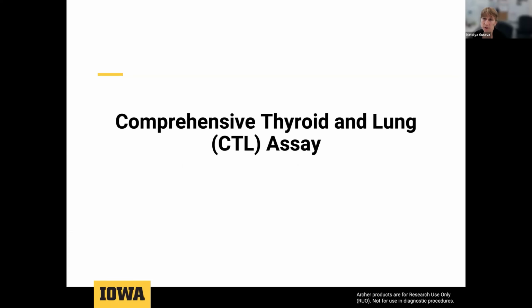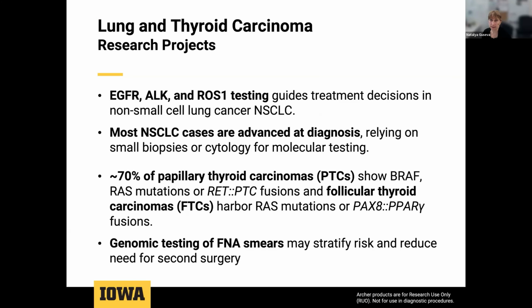On the next project, we were thinking about lung and thyroid specimens. Molecular testing is important for lung cancer specimens. Three commonly performed molecular tests in non-small cell lung cancer are EGFR and KRAS mutation testing, and ALK rearrangement, which is usually done by FISH. The molecular profile of lung cancer is complex and heterogeneous, and molecular testing can provide guidance for therapy.